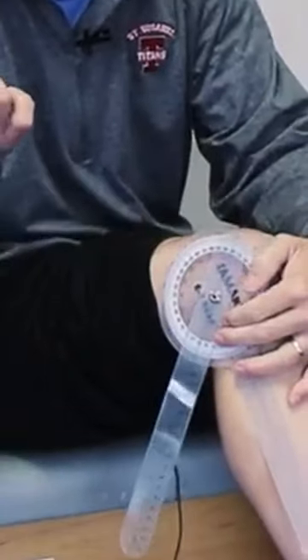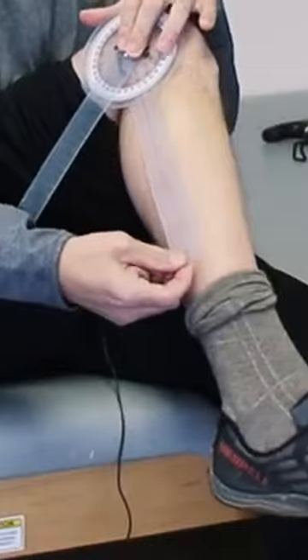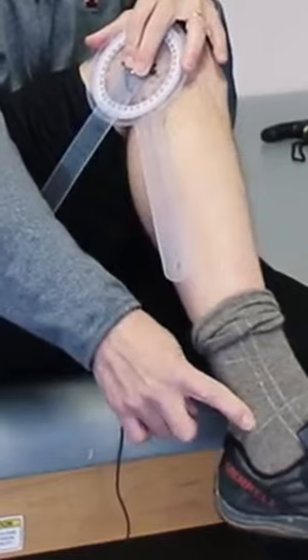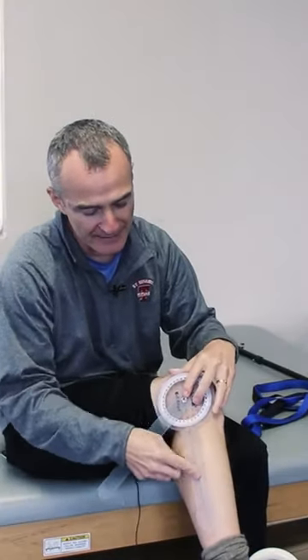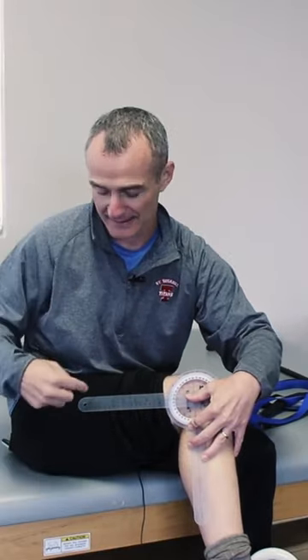You can get a marker or a pen and you might be able to create a little dot. I line that dot up. I want to line this up with that bump so you can put a little dot through that hole. So I'm lined up the same way. So I've got a dot on my knee. I've got a dot down here. I would put another dot here. So now I've got three dots. A dot at the top, a dot at the bottom, a dot in the middle.